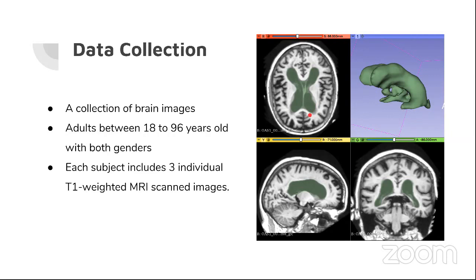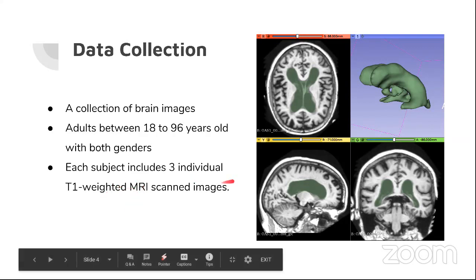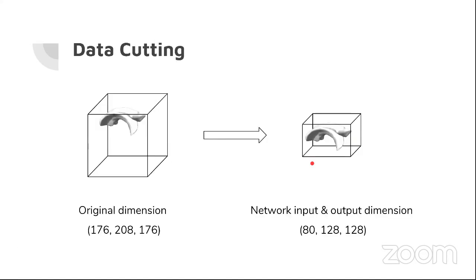As you can see in the picture here, it shows the image of the ventricle that we segmented out from the whole brain in 3D Slicer. Next, also in 3D Slicer, we transformed the diagonals of the segmented data to -1, -1, 1, 1, and converted them to a Python-ready format. Since the dataset is not large enough, data augmentation for both inputs and outputs is needed to prevent overfitting. So next, Yakun will talk about data processing.